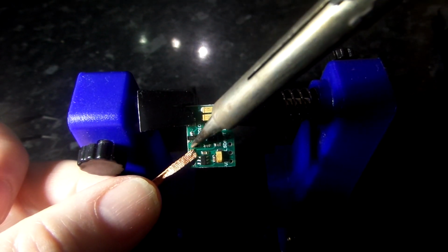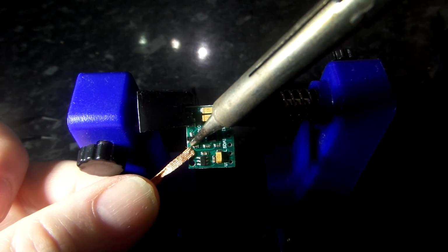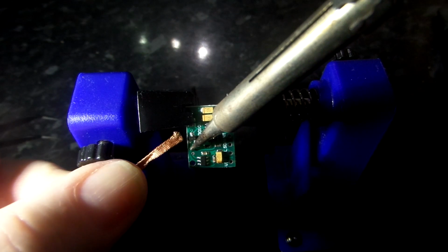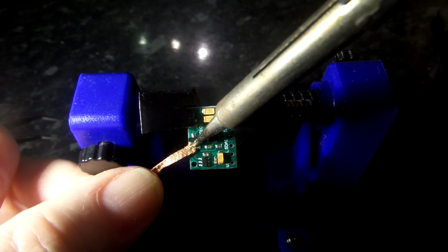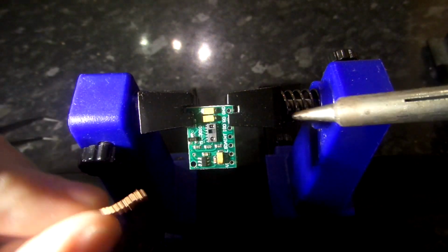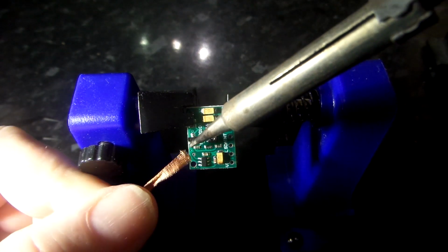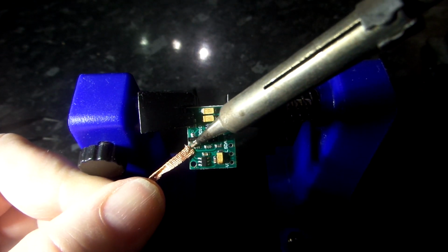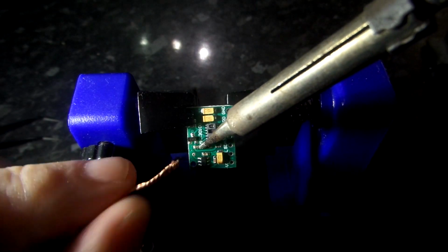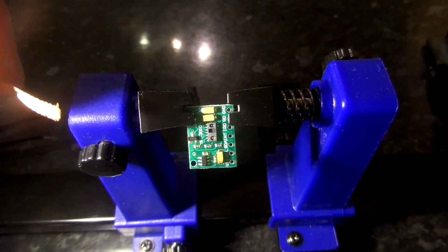Very, very awkward trying to shoot this with a camera. Go on. And so amidst all that struggle that I'm doing, slightly knocking the camera, it went off. The camera does have some sort of issue where it will go off at the slightest touch and needs replacing. Let's see if we can get this. Really, I'm at the wrong angle here. Let's see if we can just get in this way.